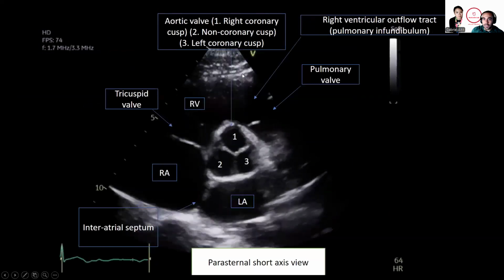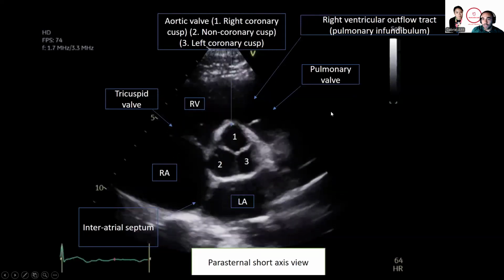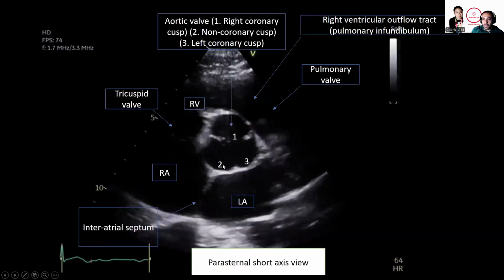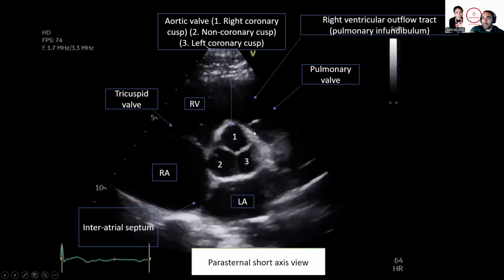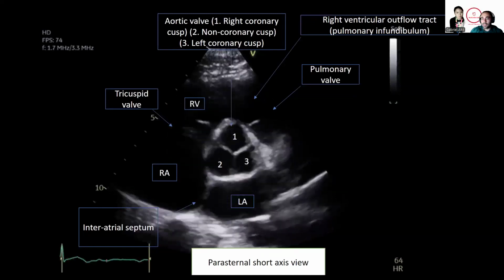So remember, this is the anterior pulmonary valve. The pulmonary valve is more anterior. It's actually more to the left of the aortic valve, which is kind of central, coming out. So if we follow it, it's coming out and then curving and giving our descending aorta.